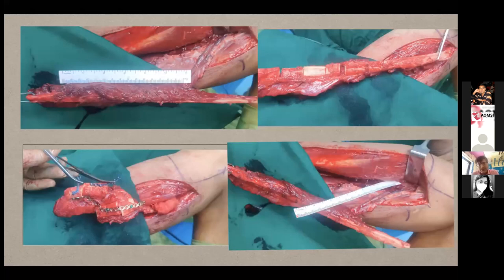All the plating is done while the bone is still attached to the leg. This is to ensure that, until the end of the procedure, the ischemia time is reduced, meaning the bone is still being vascularized during all this process. At the end of implant placement and fixation, we would know that every component of the flap is still bleeding. I mean, the bone, the muscle and the skin, all three components are still bleeding.